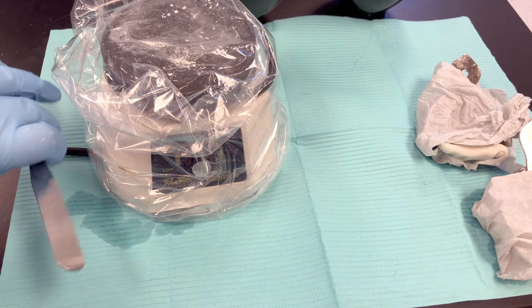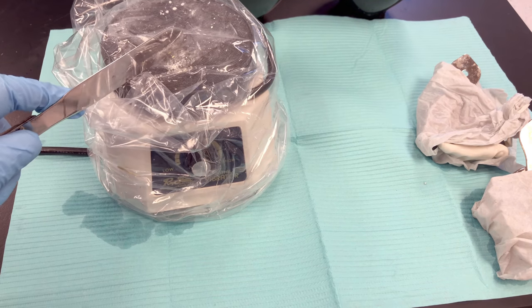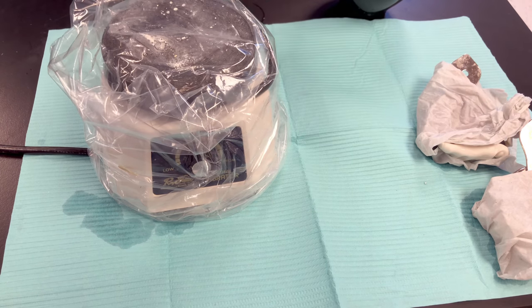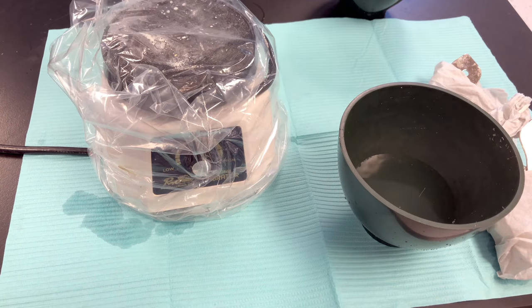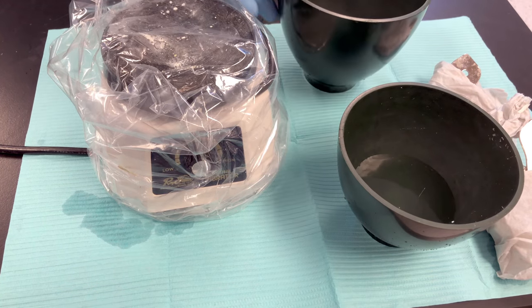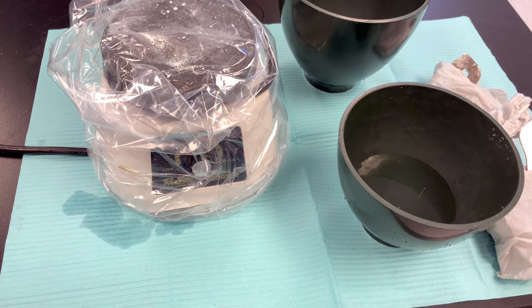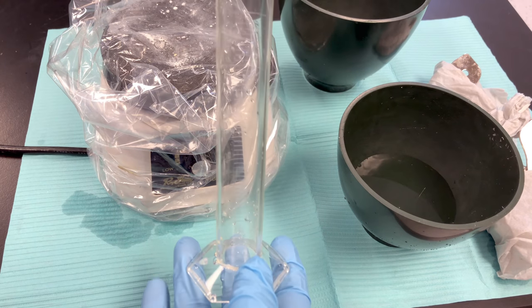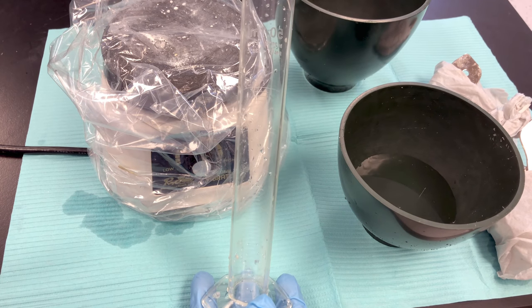I'll need my plaster spatula and plaster vibrator. I have my water measured out in two mixing bowls, one for each model. I'm using ortho plaster, so that requires 35 milliliters for every 100 grams of powder.